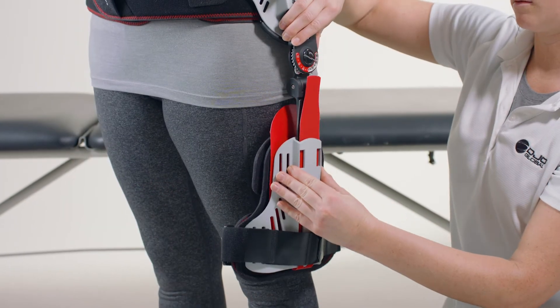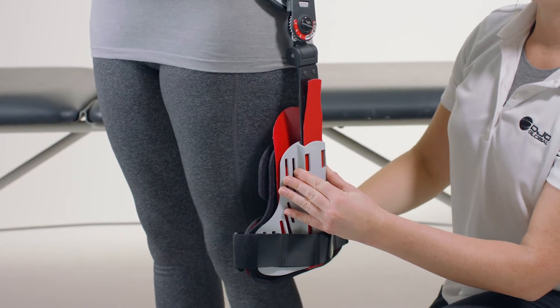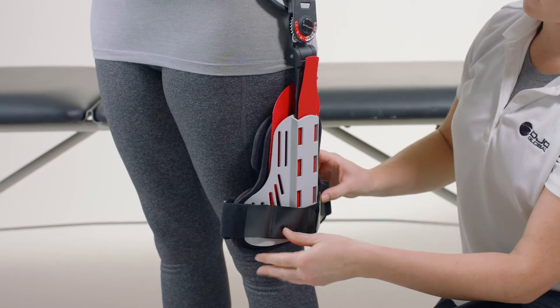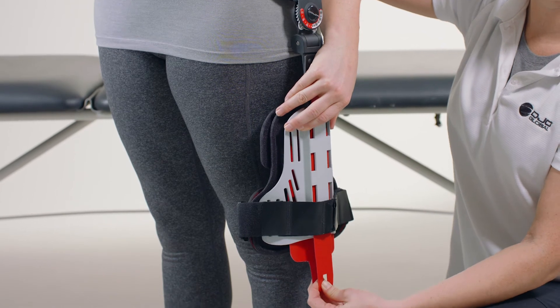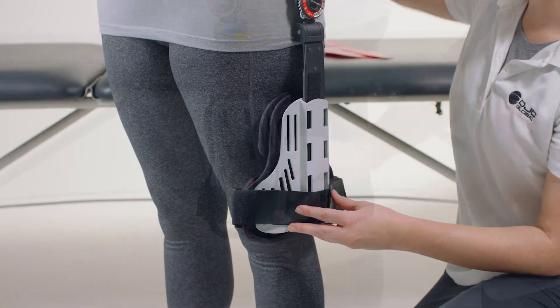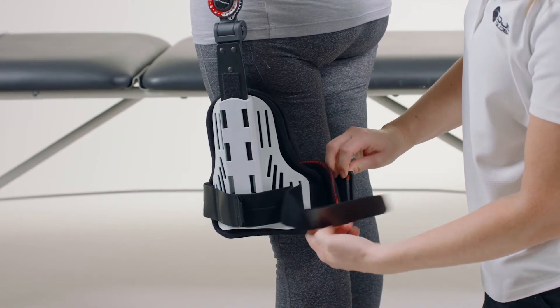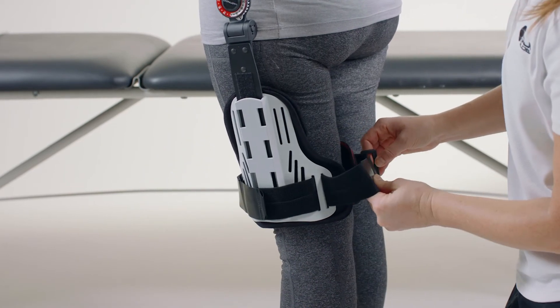Slide the thigh component to the desired position. Be sure to leave enough clearance for knee movement. Reposition as necessary without removing the red protective strip. Once the thigh component is in the desired position, remove the red protective strip. Press the shell firmly against the distal bar to fully engage the hook and loop. Wrap the thigh strap around the leg and adhere the hook and loop tab.